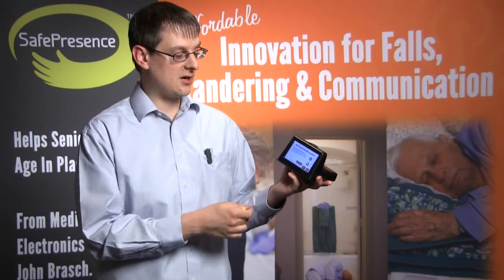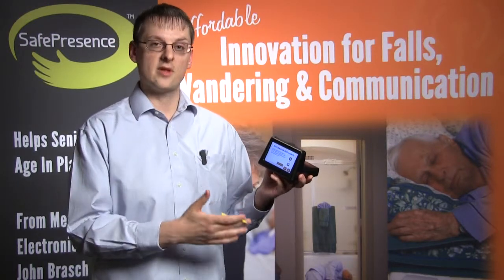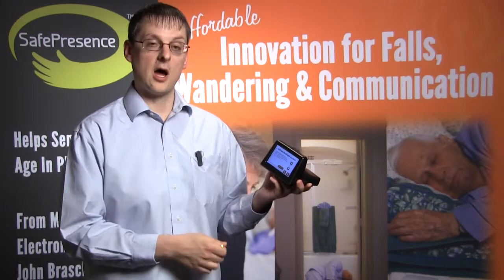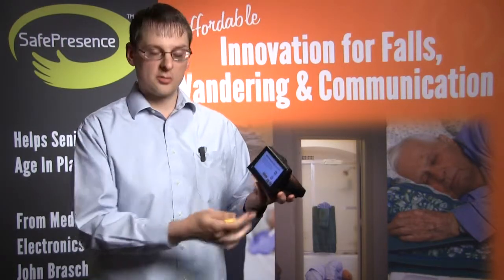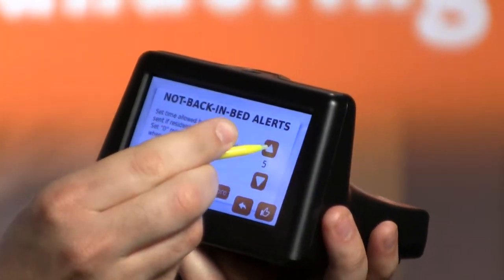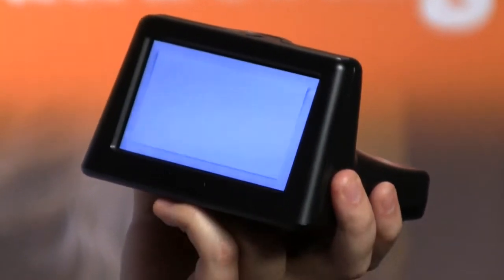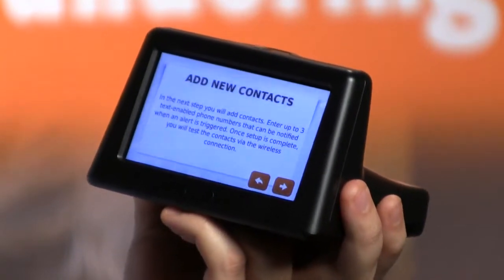The next screen we see here is the not back in bed alert. Now, the system does 3 sets of alerts. They have the not in bed, the not out of bed, and then this one, the not back in bed. This is for if you get up in the middle of the night and you go to get a drink or go to the bathroom. It gives you a little bit of leeway before the device starts sending out text messages. So in this case, let's say we want to give ourselves 15 minutes. I can hit the up arrow here and pick 15 minutes and then hit set. Now if I wake up in the middle of the night, I've got 15 minutes to return to bed before the device starts sending text.